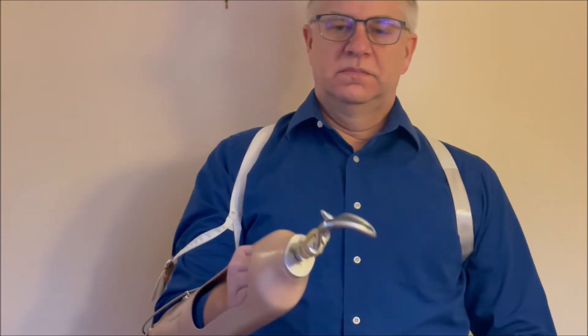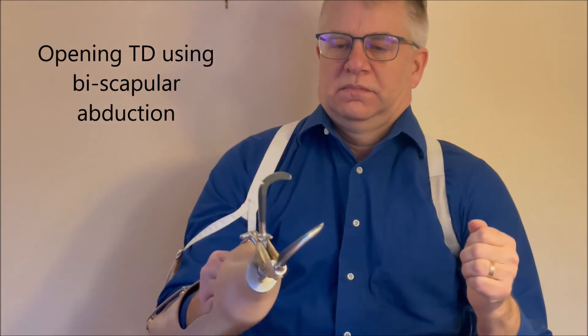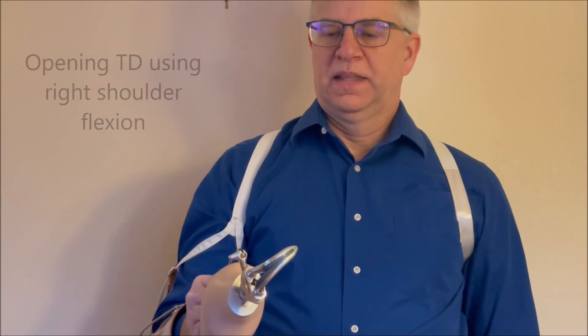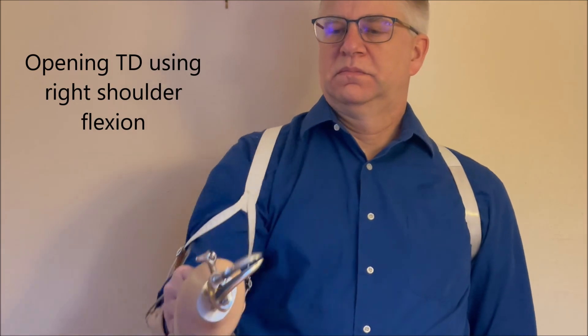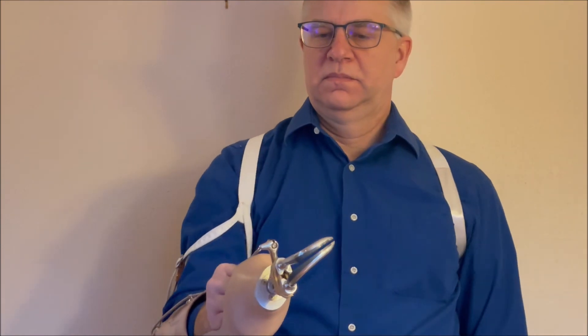This is an active open terminal device. You can rotate it to grab whatever you need to, and to open it, you can use biscapular abduction, or you can open it using right shoulder flexion. The rubber bands on the terminal device close it automatically.